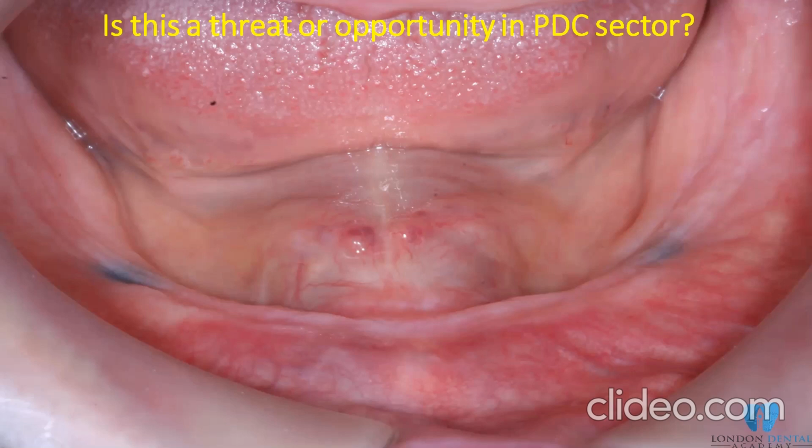It has to be warm, really warm, and soft. The viscosity of the material would help it flow inside the area. If it doesn't flow in these areas and doesn't depict all these details, then we have to make it flowable so it can capture all the undercuts. What I normally do myself is push my finger in that corner and push my green stick material in that part of the impression compound to pick up as many undercuts as we can.